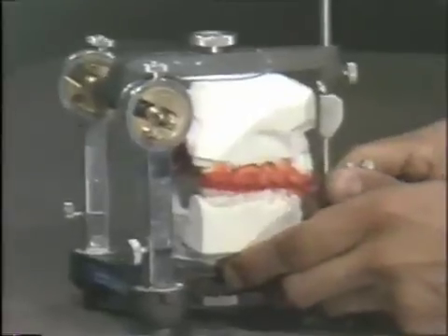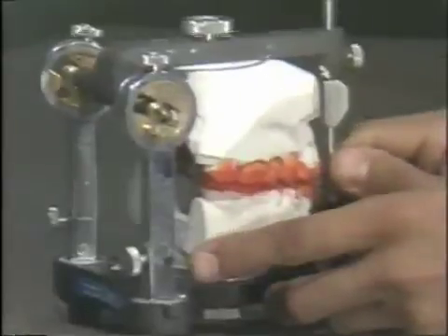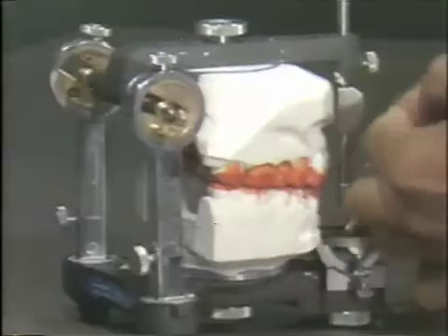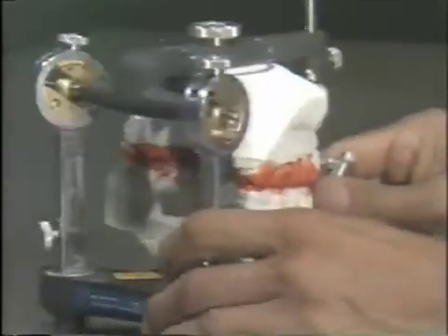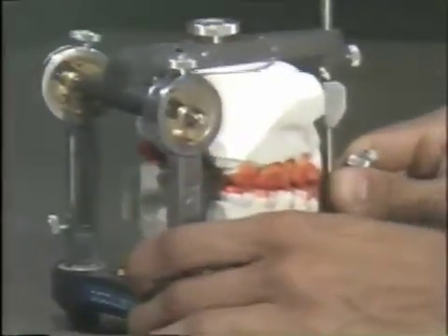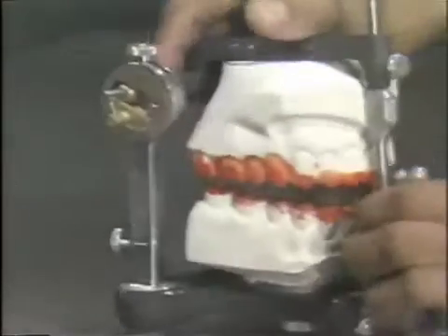Again, this is from the centric occlusion position. The shims are in. Rub it back and forth, then go on the other side to the balancing. I'll put the ribbon on the other side — you can see the ribbon sticking out a little bit there — and do the same excursion, and begin by checking the maxillary teeth.